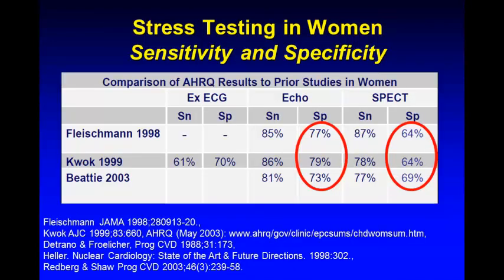Now, we always talk about our great diagnostic accuracy, and we always quote high numbers from the published literature. But I can tell you that the published literature does not always equate to data in the field. So here are 3 relatively old studies that looked at specificity, for example, stress echo versus nuclear in women. And you can see, although we have excellent sensitivity, our specificity is not too high, especially because of artifacts.